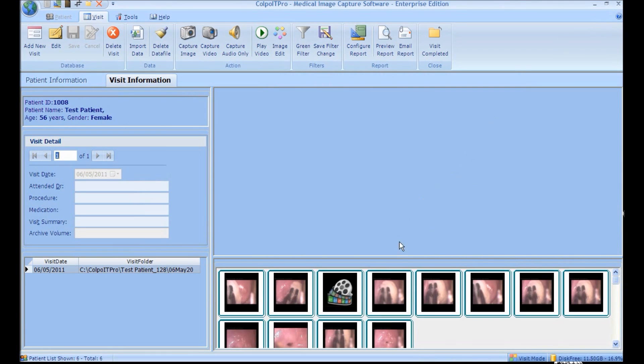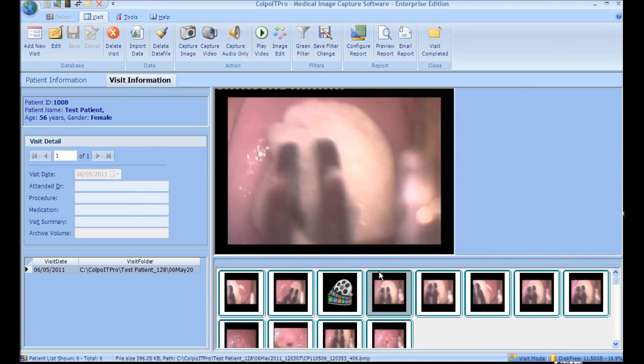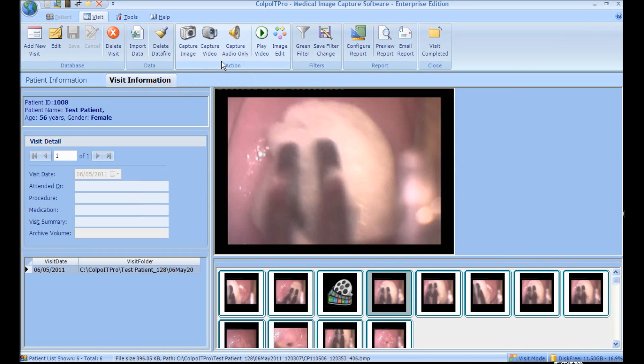Similarly, you can capture an image and record audio by pressing the Capture Image and Capture Audio buttons respectively.